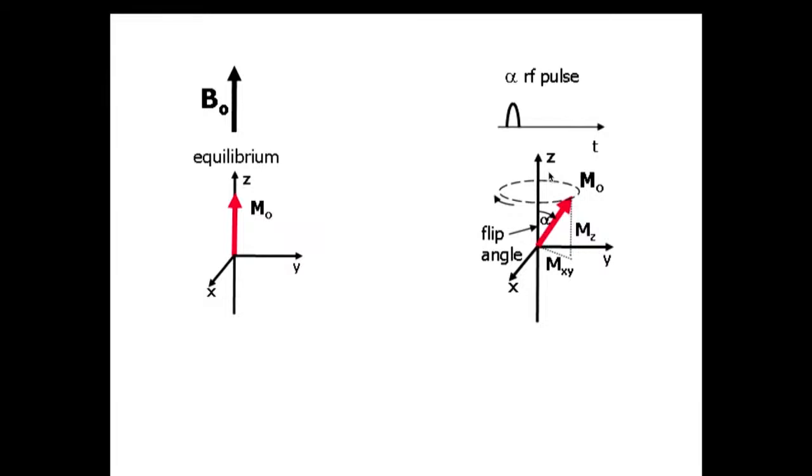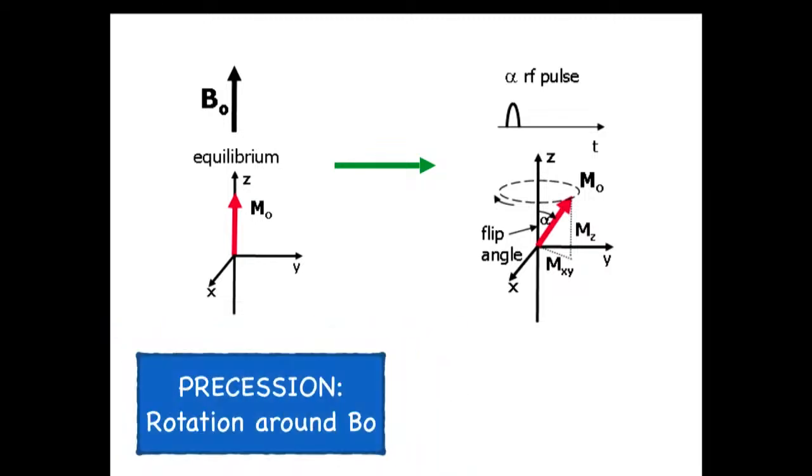So now all of your magnetization would go from the longitudinal plane, which is upright, into the transverse plane, right? And if you did a 180, what happens? It goes all the way down to the bottom, right? So again, depending upon the radio frequency pulse that you applied, you cause the protons to go to a different excited state.